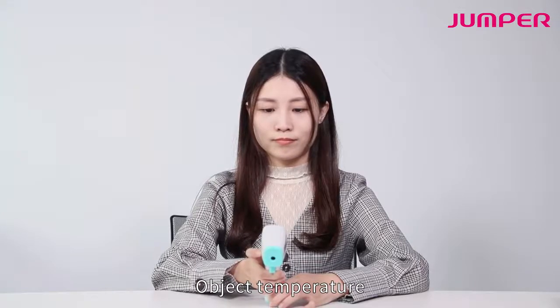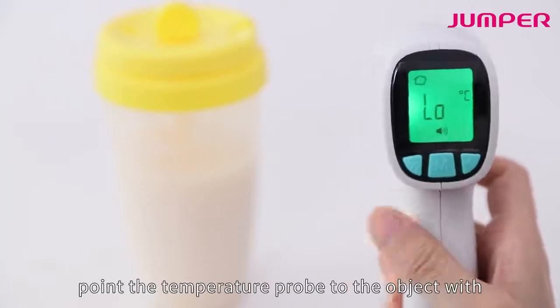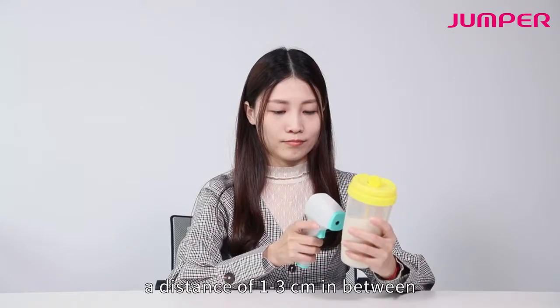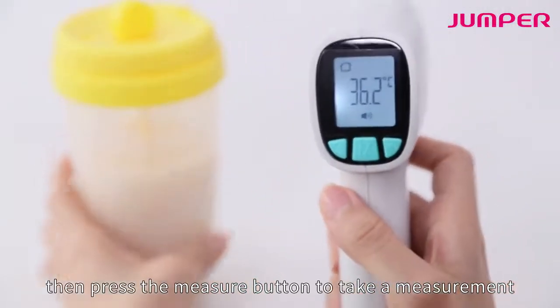For object temperature, press the mode button to choose object mode. Point the temperature probe to the object with a distance of one to three centimeters in between, then press the measure button to take a measurement.